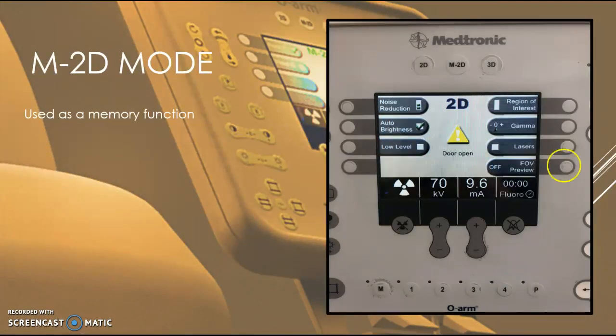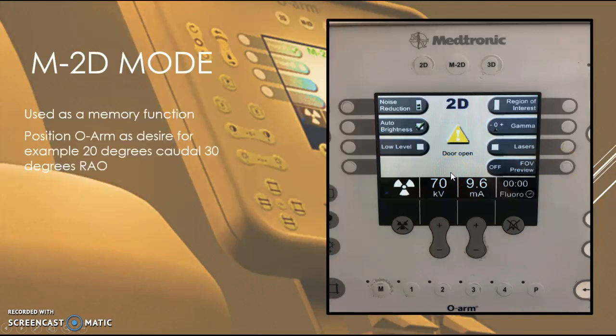So M2D mode. M2D is just a mode that's used for memory function. If you need to do some kind of crazy angle like 20 degrees caudal, 30 degrees RAO, and the surgeon tells you to come back in with the O-arm and do that exact same view again, well, before you pull the O-arm out, you want to hit M, and then you can store it on 1. So whenever you drive the O-arm back in and you need that radical position, you just hit M and 1, and it will move the O-arm into place for you. You also have 4 memories that you can use. So you can store up to 4 different positions on the O-arm.